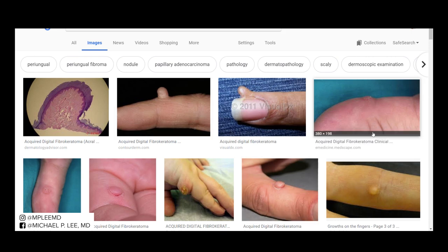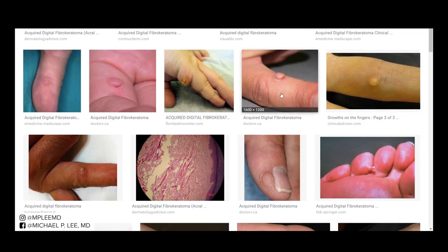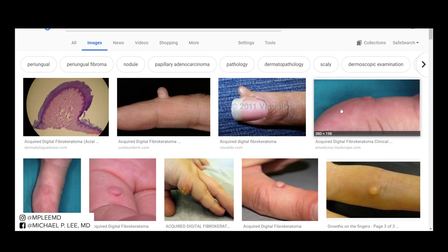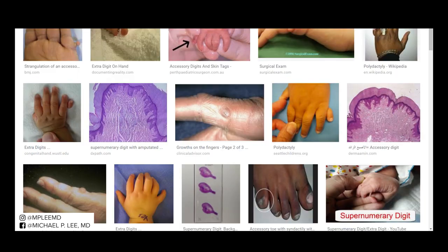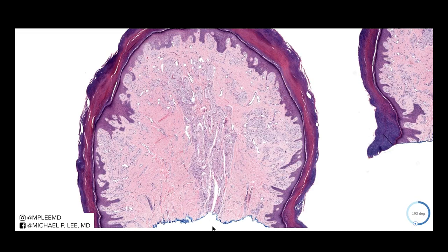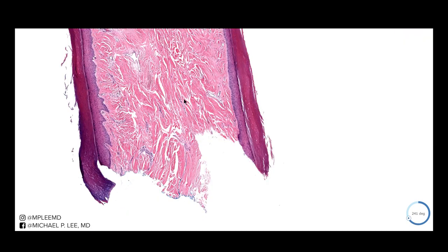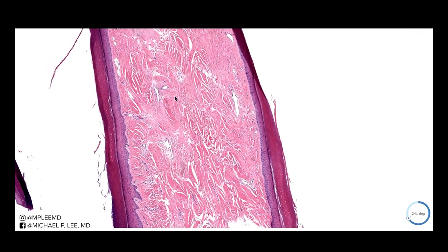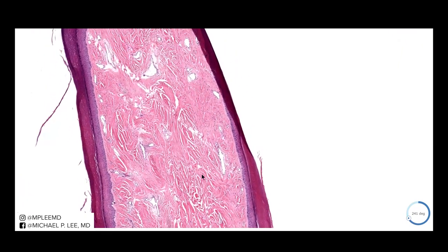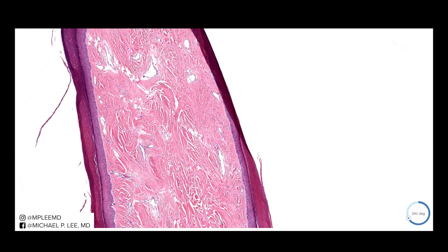So that's the main differential when you see these things. The accessory digit has nerve bundles, oftentimes oriented upwards as well. Acquired digital fibrokeratoma has no nerve bundles — just fibrovascular tissue in the center.